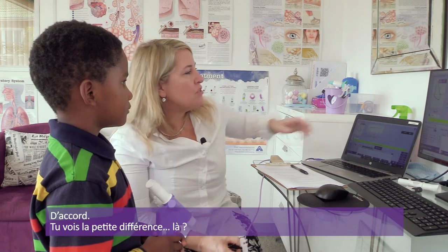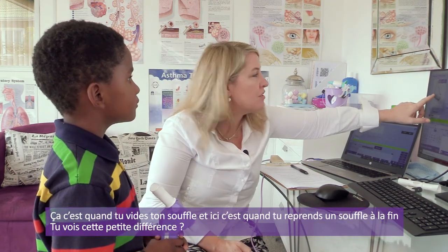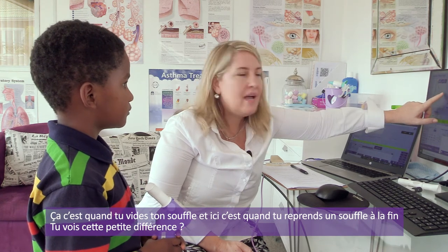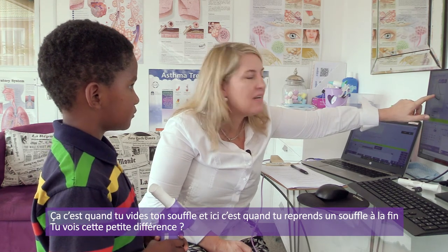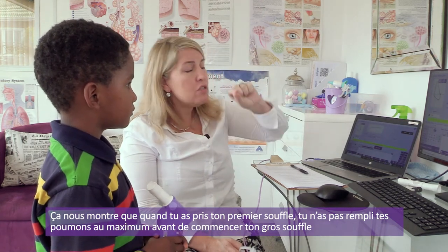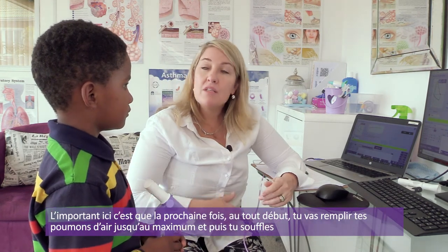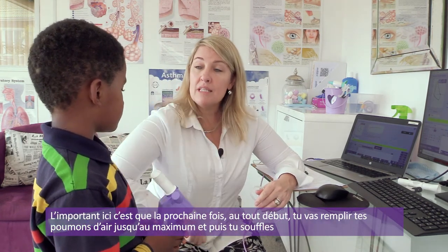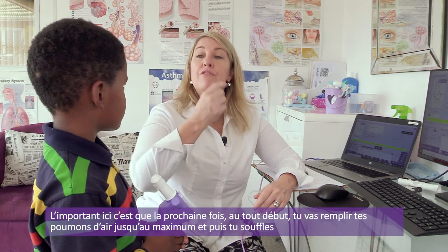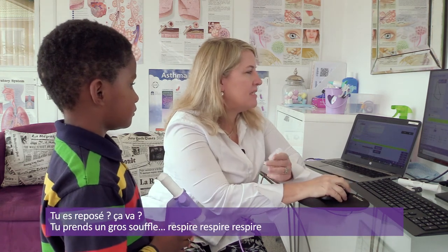Okay, now what I want to show you is, can you see the difference there, that little difference there? So this one is when you breathe out, and this one is when you breathe in again. You see that little difference? It just shows us that your lungs were not totally full before you began to blow. So the important thing that we're going to concentrate on in the next blow is that you breathe in to fill your lungs to the top, and then blow. Got it? Good. All right, let's try again.